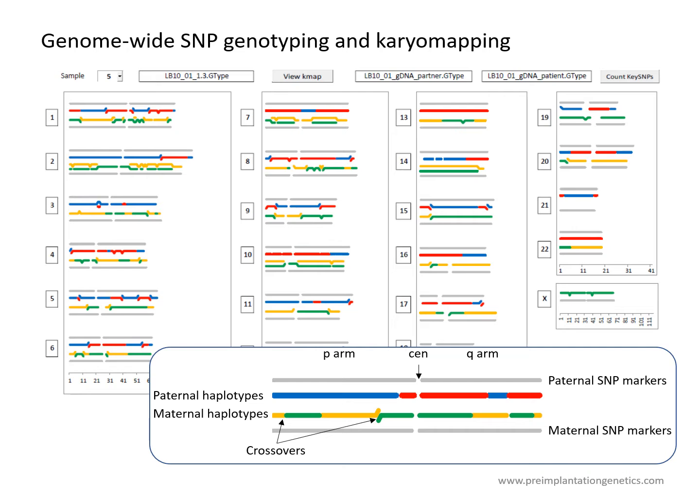To test this, we identified meiotic errors through polar body analysis for maternal errors and karyomapping of DNA amplified from the trophectoderm biopsies at the blastocyst stage, as seen here in this example. This then allowed us to measure the corresponding copy number changes following NGS-based copy number analysis with the same amplified DNA samples from the trophectoderm biopsies.